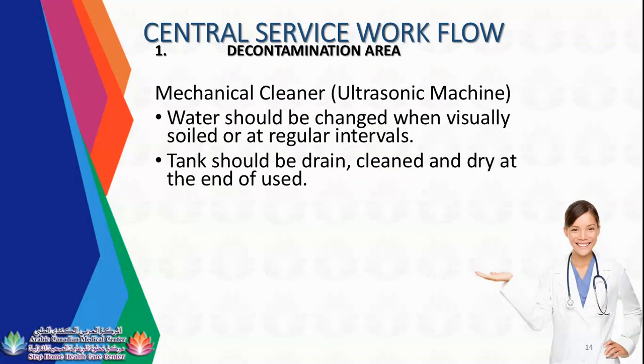So tanks should be drained, cleaned, and dried at the end of each use. If you are on a 24-hour duty, then you need to remove the remaining chemicals, cleanse the tank with tap water, and you can rinse it with distilled water as a final rinse, and then dry it out.